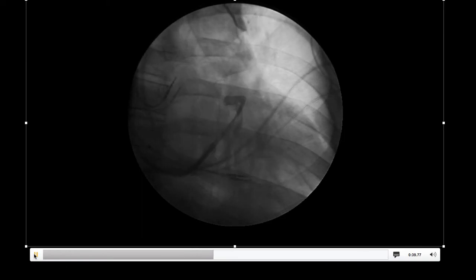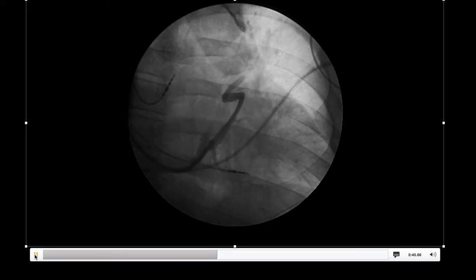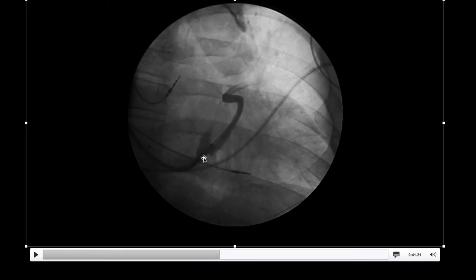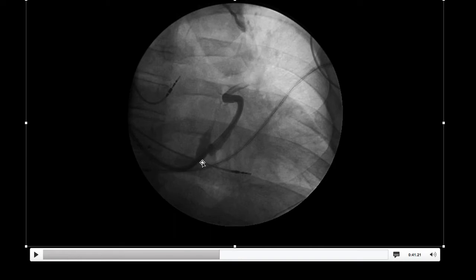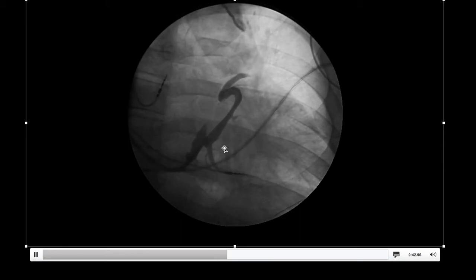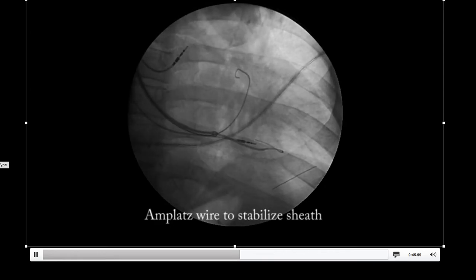We're really not in the CS proper here, so we had to put a wire up, stabilize, and then switch from the vein of Marshall over into the body of the CS. This area right here is the vein of Marshall; above it is actually the great cardiac vein. Below that is the true CS, and the Thebesian valve is right in here. So we were able to get in and place an LV lead.